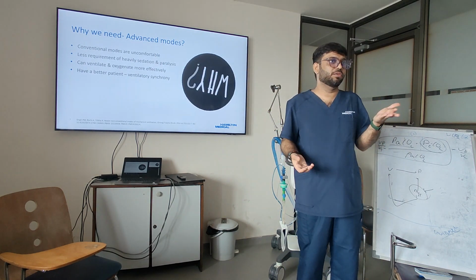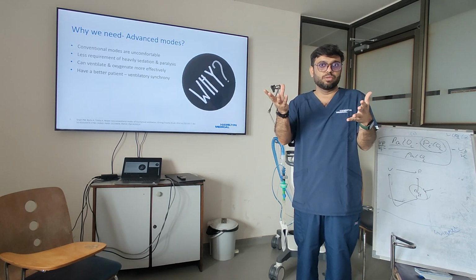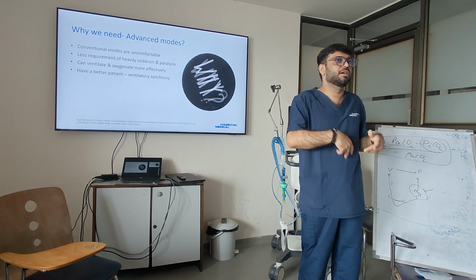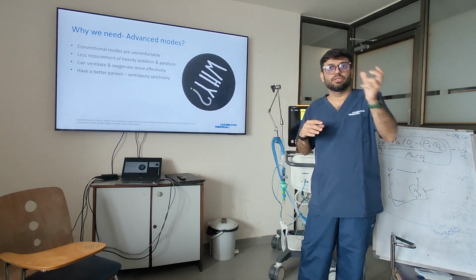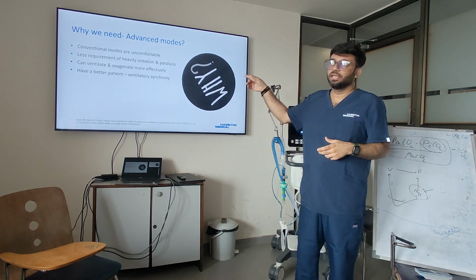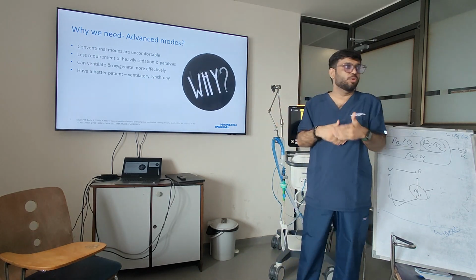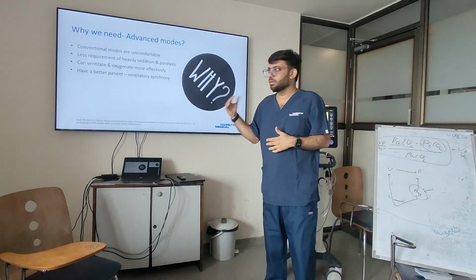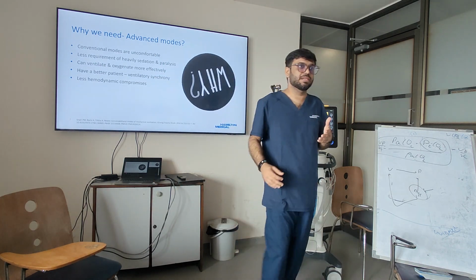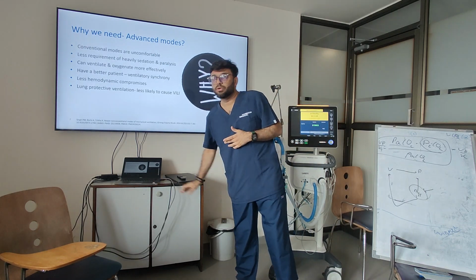It is also observed that with the conventional modes, for patient synchronization, we change the mode. Initially we start with assist control, and then we see that the patients are awake, and then we change the mode. We come back to spontaneous or SIMV, and we try to bridge that gap more manually. But here, since it is more closed loop, the machine is going to do it on its own. So you will have better patient-ventilator synchrony. And if that happens, you will have fewer hemodynamic compromises with more lung protective ventilation.